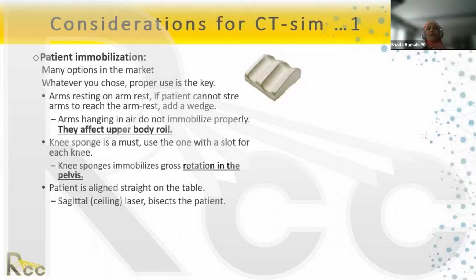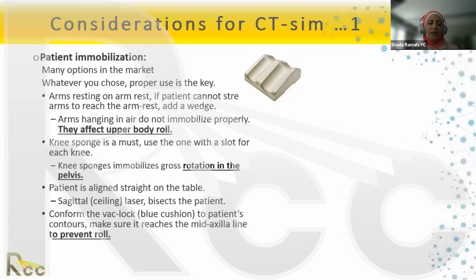Let's say you're focusing on treatment of somewhere in the chest, so you don't care how the other body parts are aligned. Wherever you're putting more stress, the entire body could either roll or rotate. And sometimes you'd have what we call a pitch. We'll come later to the definition of the different degrees of rotation.